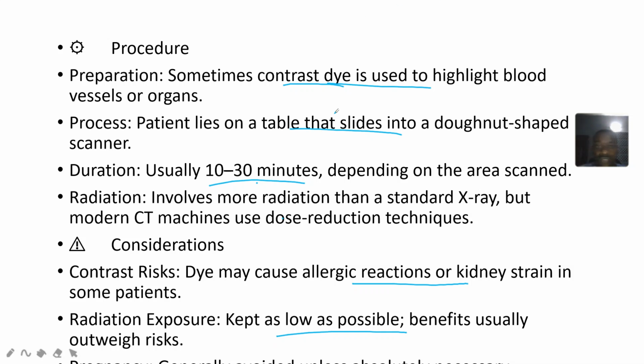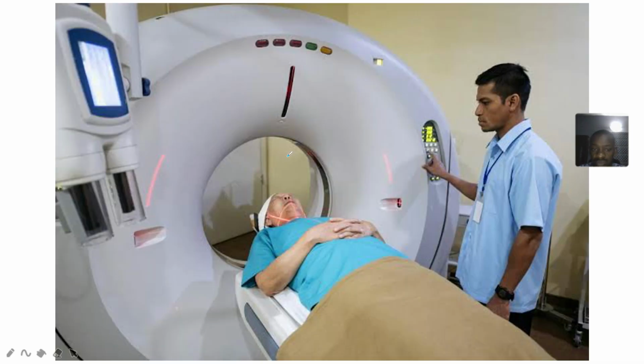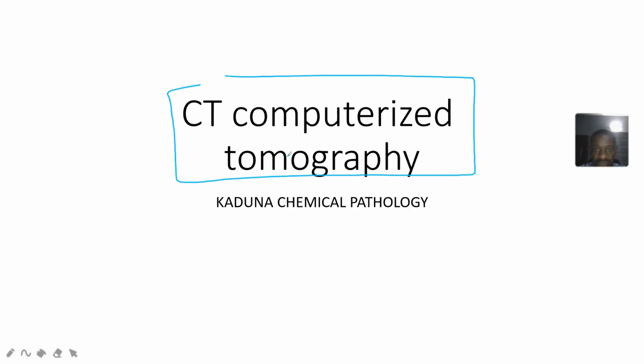Sometimes contrast dye is used. Sometimes some patients are allergic to the contrast dye. Sometimes the contrast dye has to be excreted through the kidneys, so as it's excreted through the kidney, it causes a lot of harm to the kidney. So I think this is what we have for CT scan.